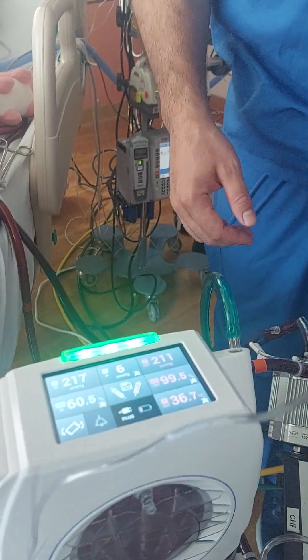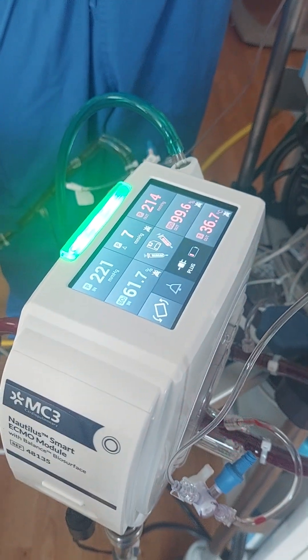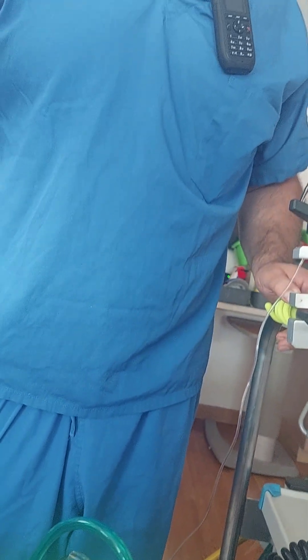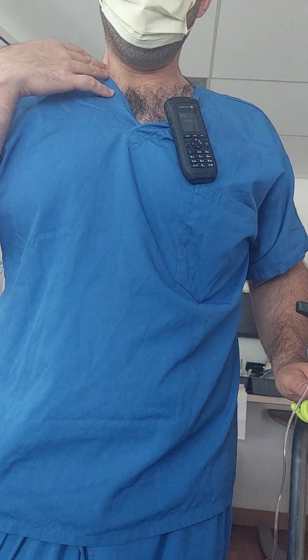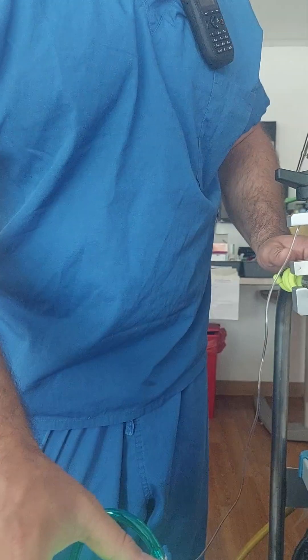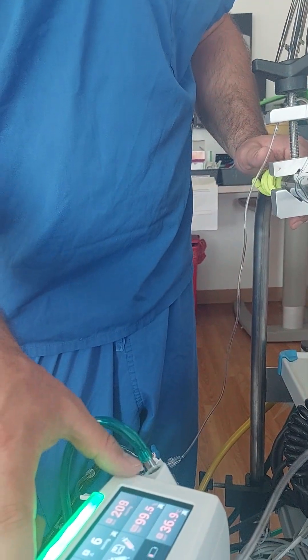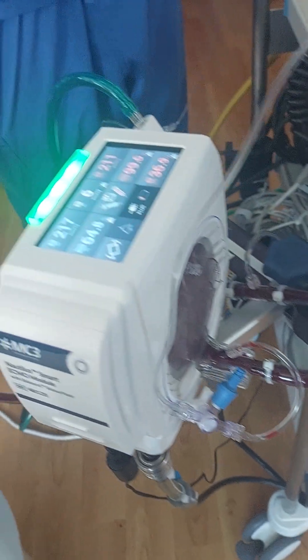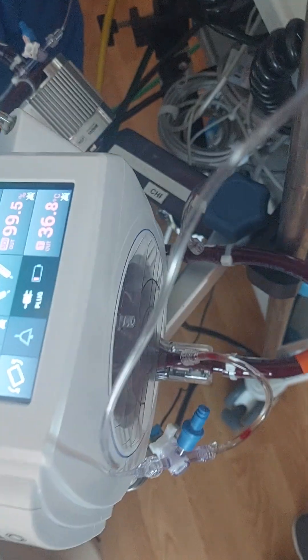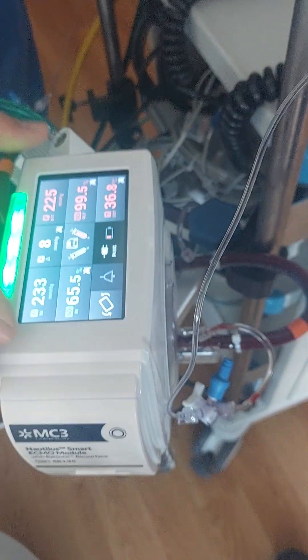Mode selection is done when the patient is cannulated, determined by the type and positioning of the cannulas. This module here — called the smart module — provides real-time clinical data on the saturation of venous blood entering the inlet of the membrane, the saturation of blood leaving the outlet of the membrane, and pressure readings.